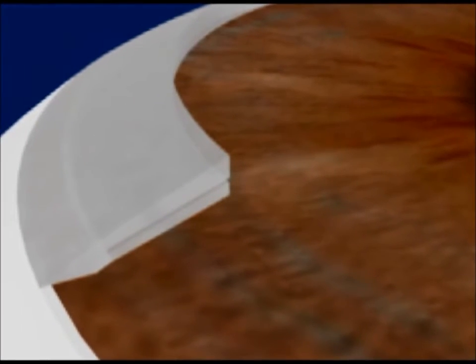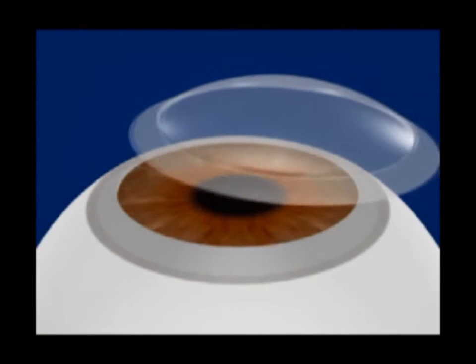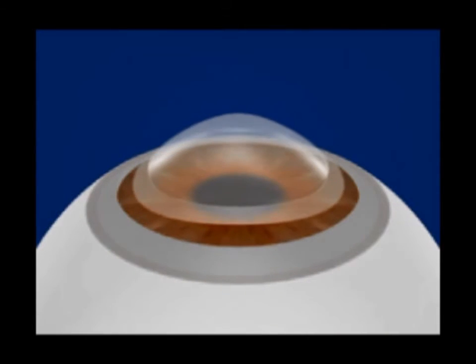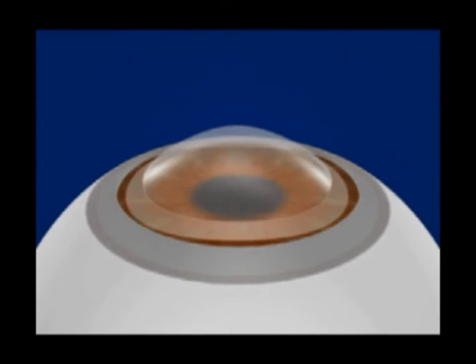As we can see, the host cornea now has a pocket which is complementary to the shape of the donor flange. The donor flange can now be fitted into the pocket created in the host cornea.